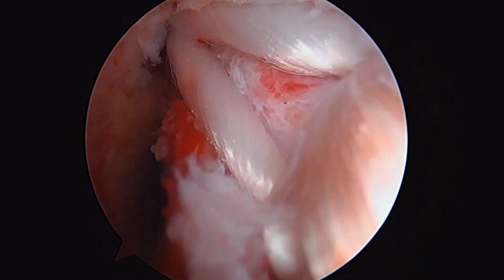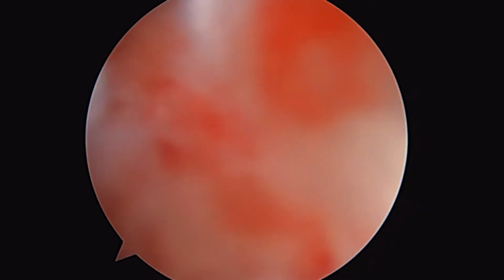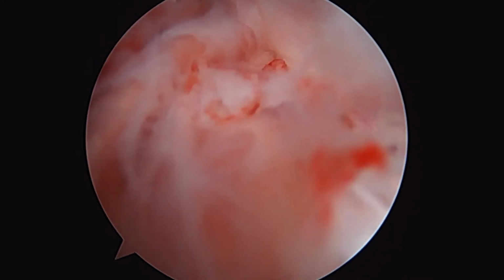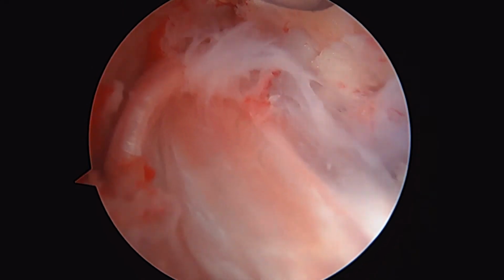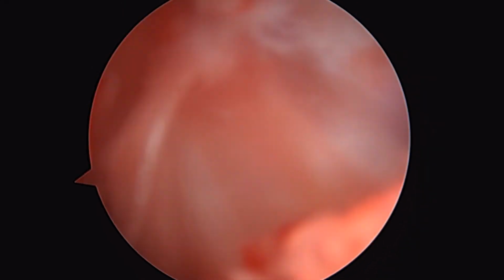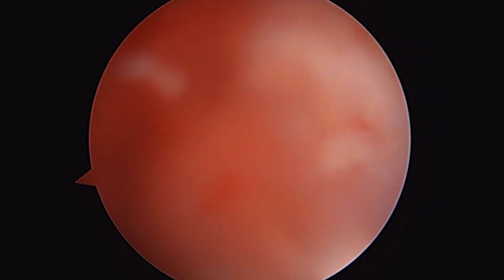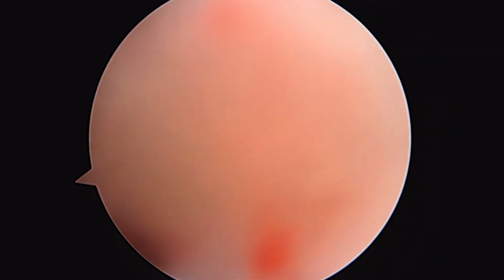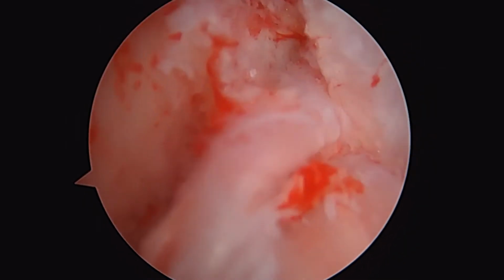Watch this in. Okay, so we're just pulling the new graft into position. You can see it going up there. We'll pull back, give you an overall picture. That looks pretty good. Keep holding. We'll see if we can flip that button now. We'll show you some more in just a second, but that's what it's going to look like in a minute.